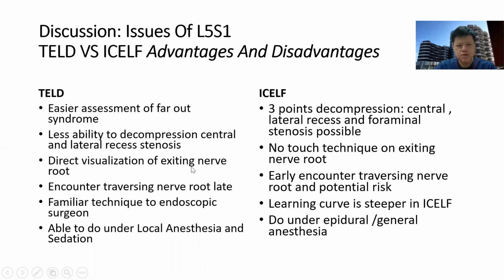There is less ability to decompress central and lateral recess stenosis, in my opinion. There is early direct visualization of the exiting nerve root, and you encounter the traversing nerve root late. It is a technique that a lot of endoscopic surgeons are familiar with, and we are able to do LA sedation. Another technique that I will be going through later is the contralateral approach.